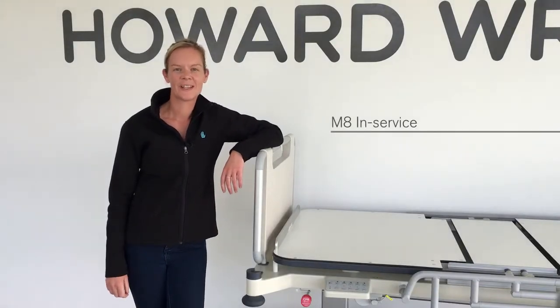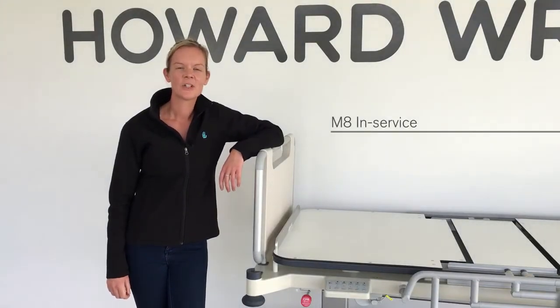Hi, thank you for choosing a Howard Wright product. This short video covers the operation and features of an M8 intensive care bed. Please read and understand the instructions for use manual and remove all packing materials before use.